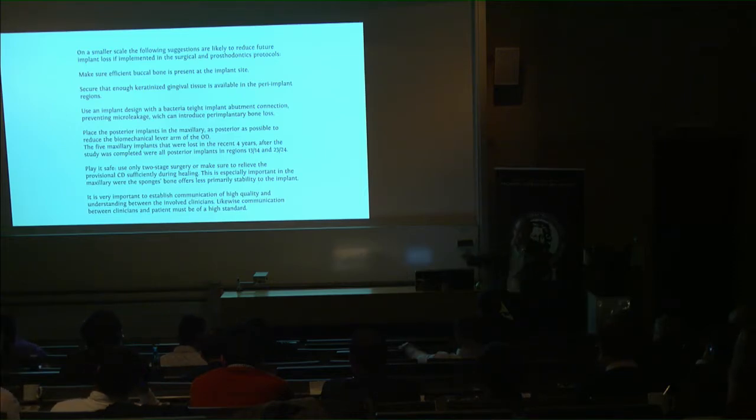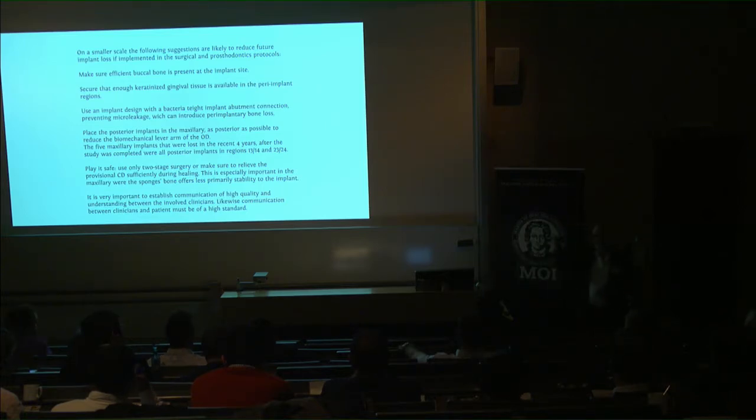And likewise, you need good communication with the patient, because it's only humans. You never know what they're going to do. You tell them something, they do something else. You need to have your hygienist keeping them on a tight leash. And 2 of the implants we lost, that was a lady who lost the attachment in the overdenture on the anterior implants, and she didn't do anything about it. So she just went on using the overdenture, and of course, she overloaded the posterior implants. And that could have been so easily fixed if she had paid attention that she needed to have these attachments replaced when losing them.